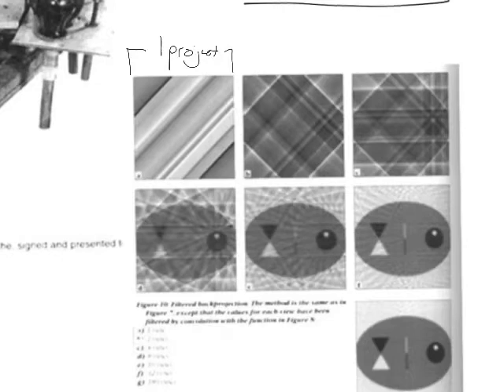We're interested in turning this stuff around, right? So we're going to keep turning it. And for example, here's 4 projections, right? So now we've shot the brain from 4 different directions, right? Now here's 8, right? Still pretty useless to me, but what we're doing now is we're back projecting it.